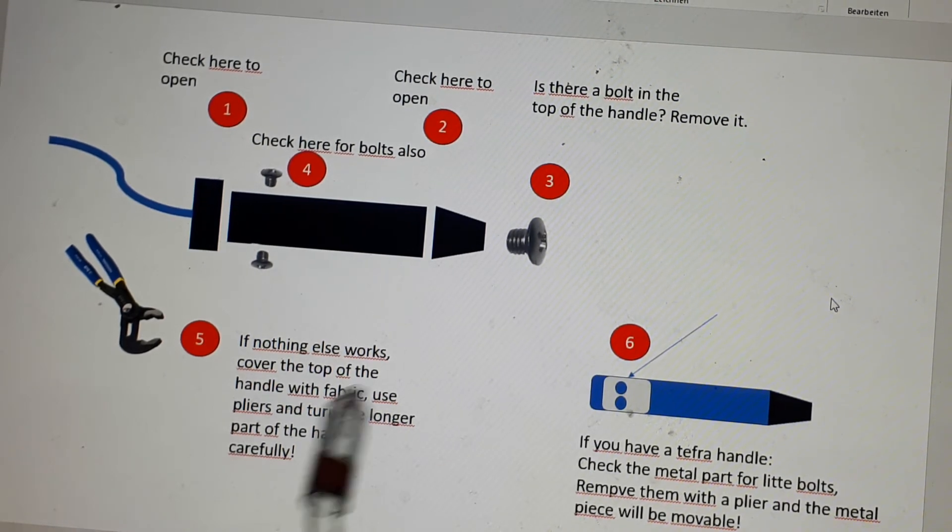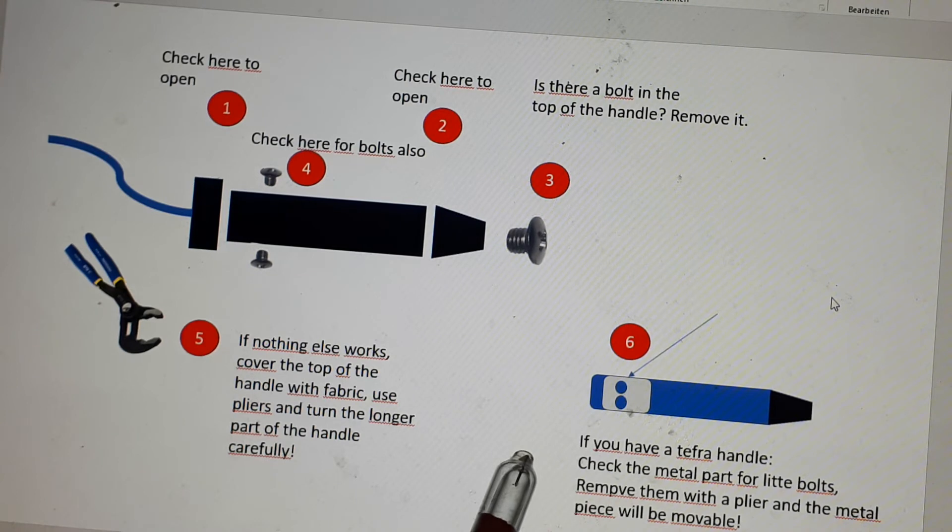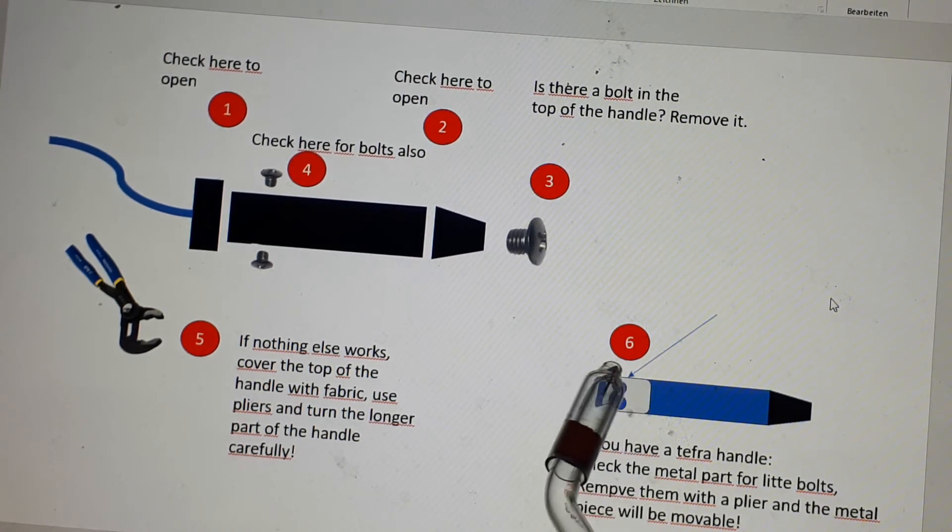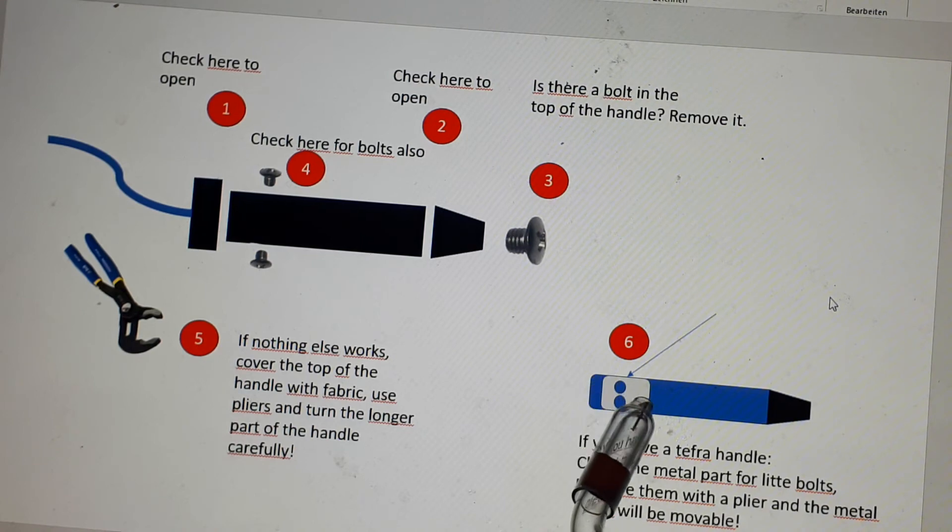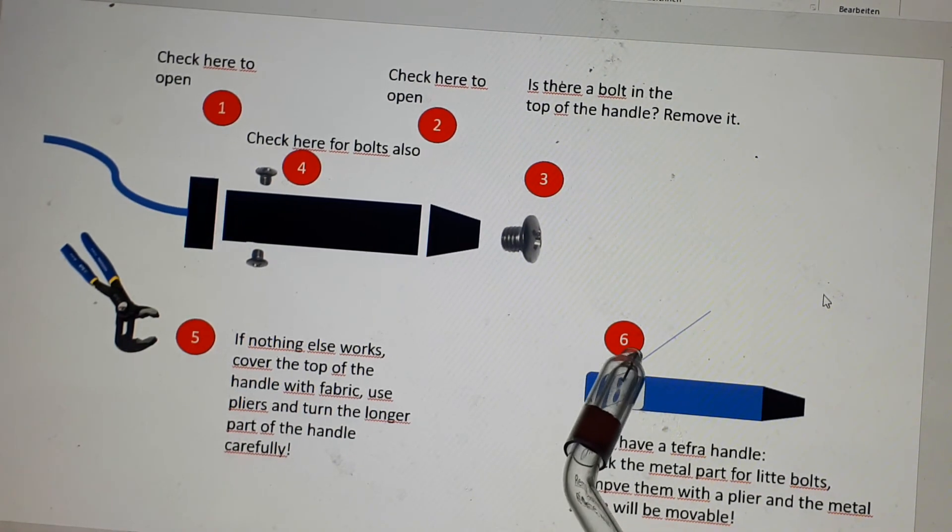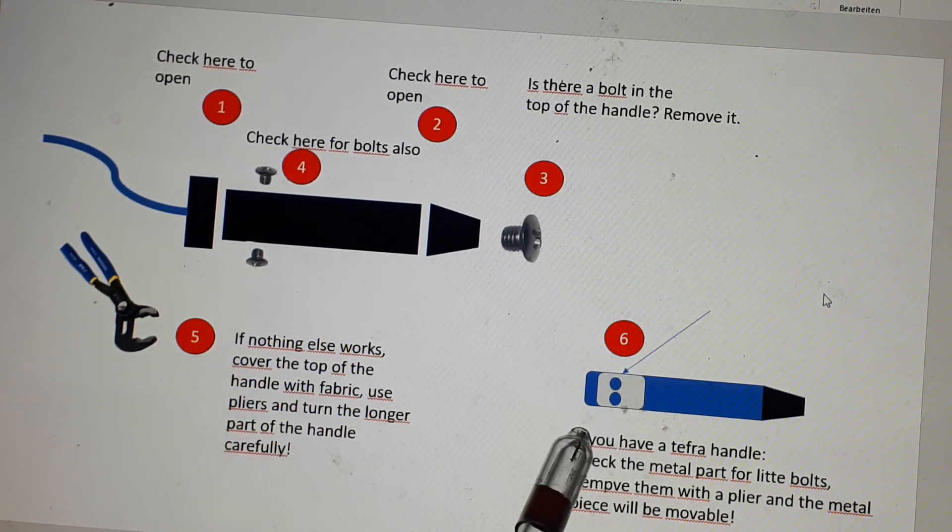Here in Germany we have some devices that are very popular here, the Tefras. And Tefras has a specialty in the handle. There is a metal sheet and it's wound around the handle and it's fixed with little bolts. And these bolts you can easily remove with a plier.